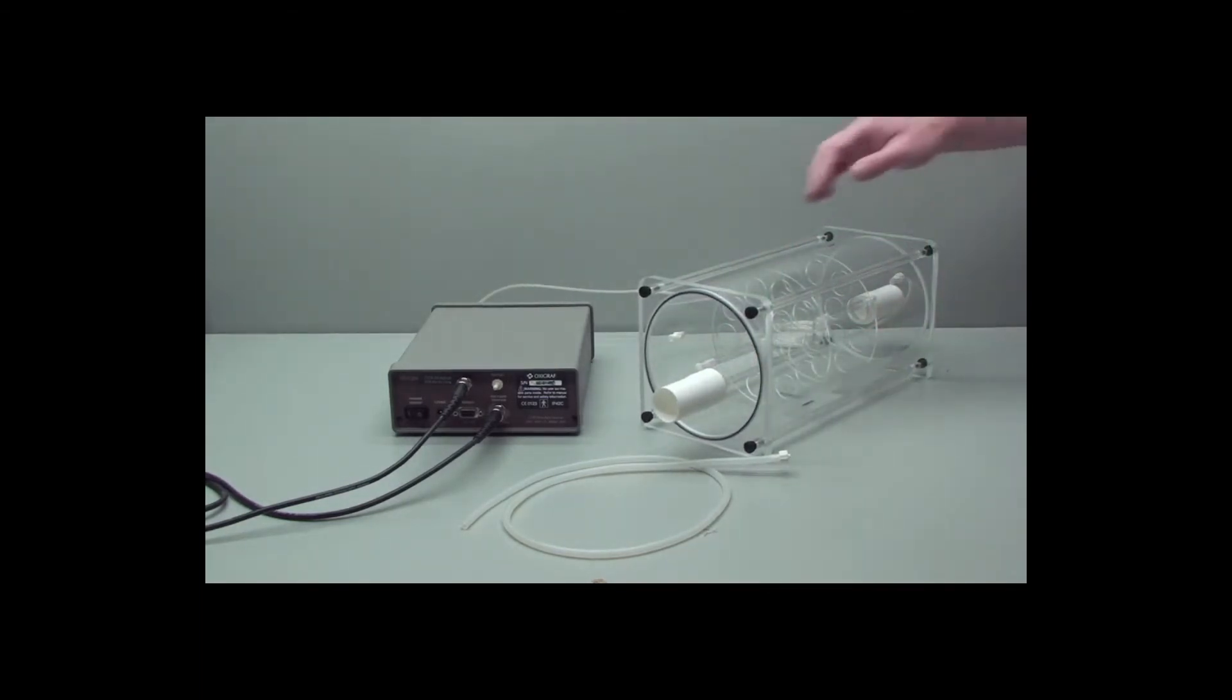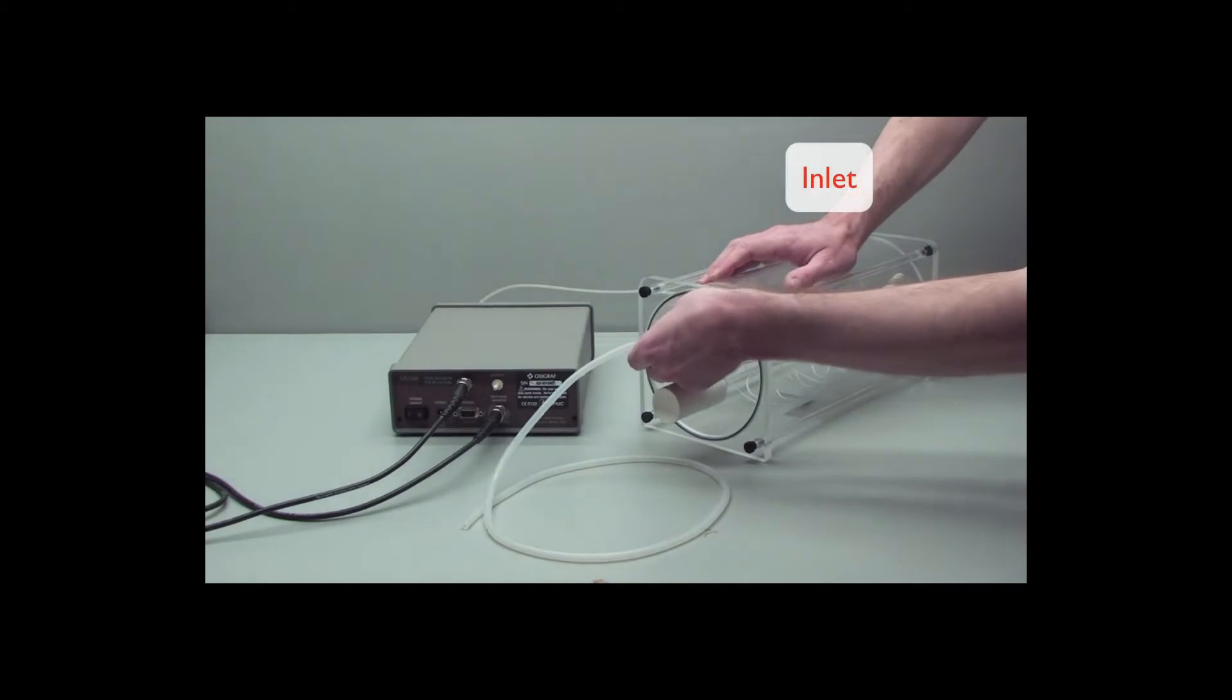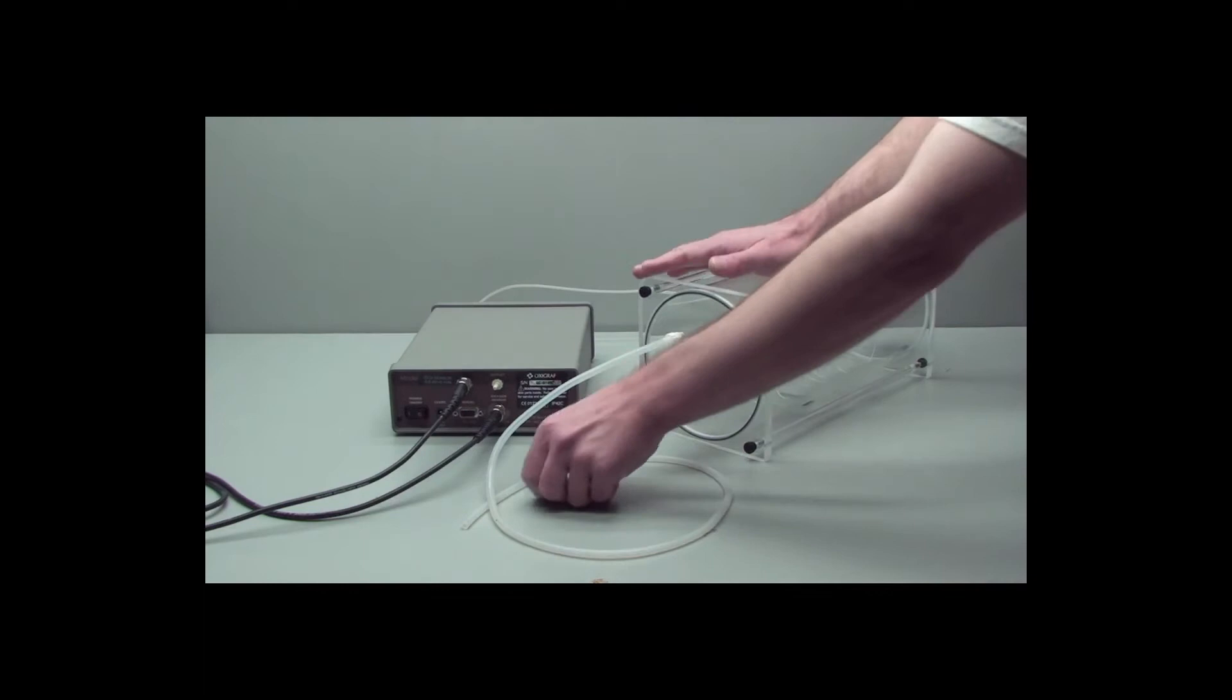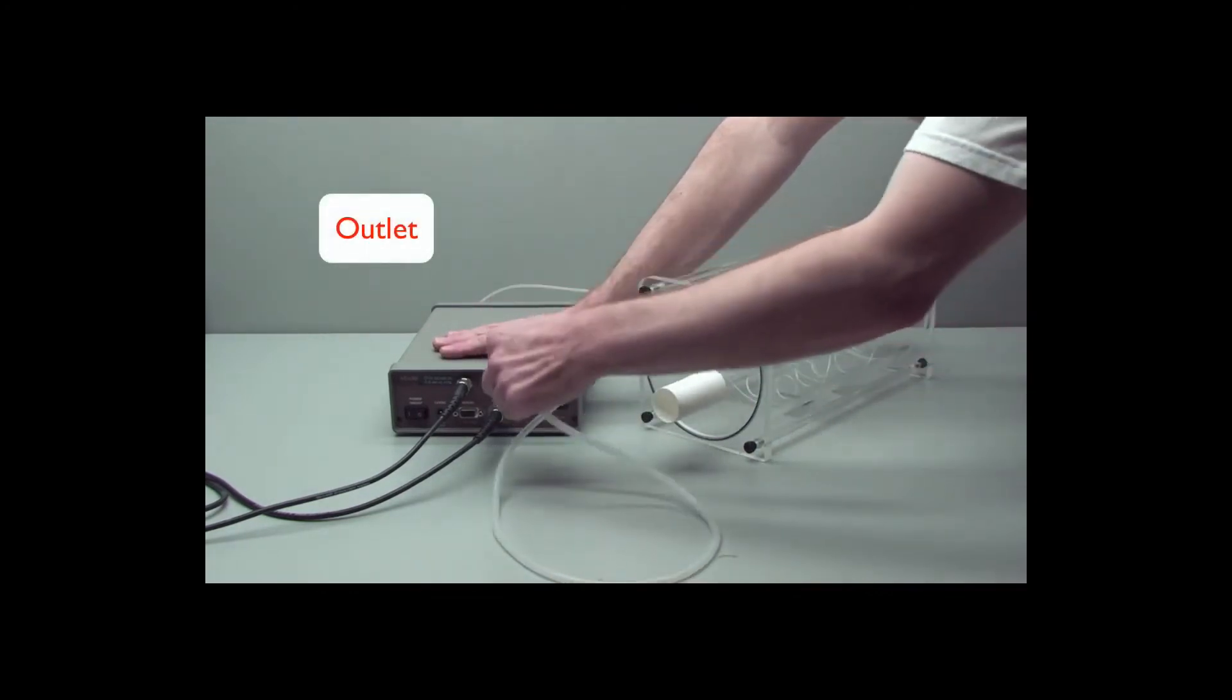Take the other tubing, and that goes to the inlet of the mixing chamber. And the other end goes to the outlet of the gas analyzer.